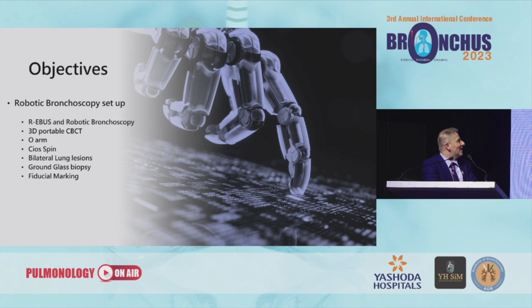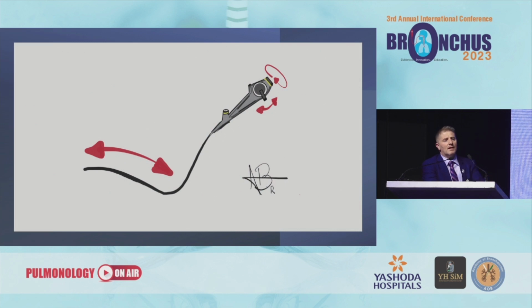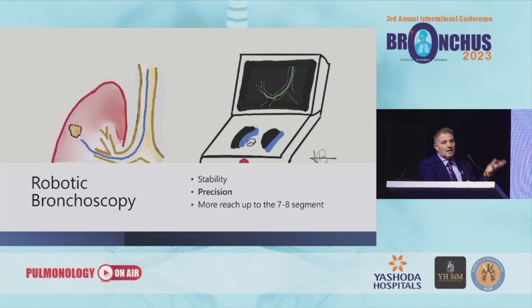And I will focus more on how you do your daily work with the platform in general. The difference between using bronchoscopes with the robots is that now you have more control with the console, so you don't have to hold the scope in the right spot all the time in case of any divergence or movement.